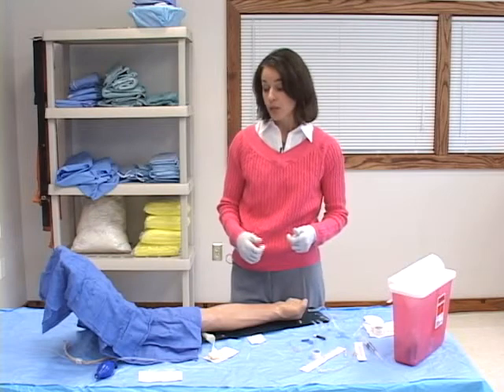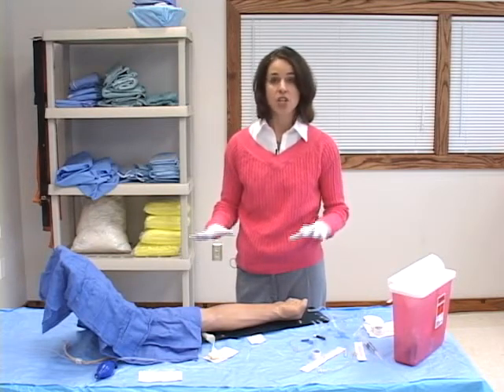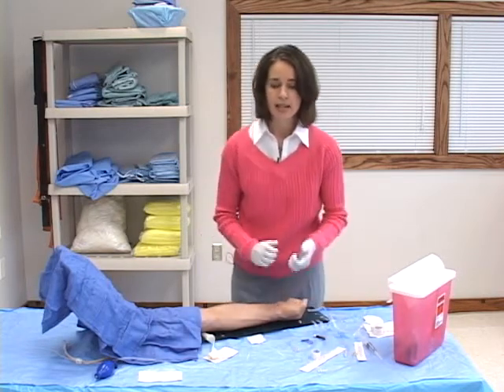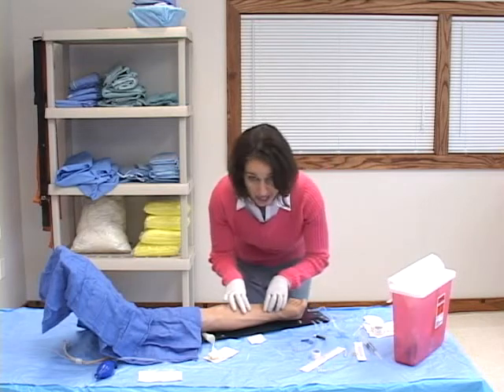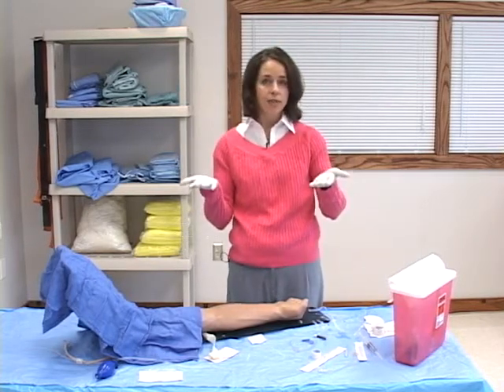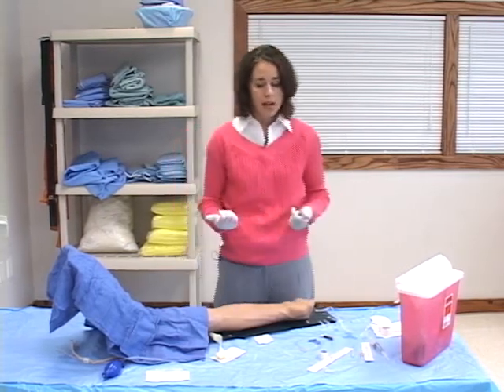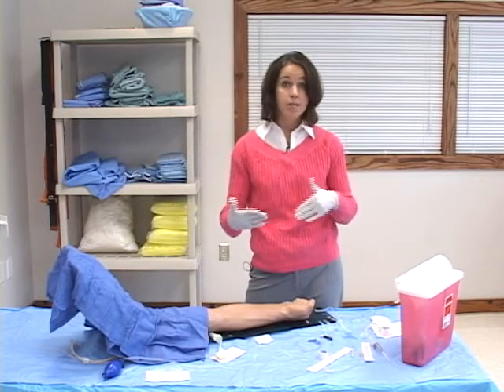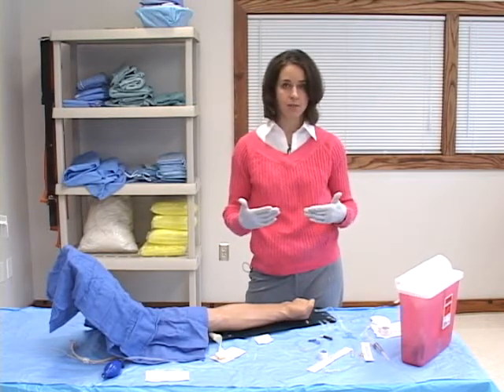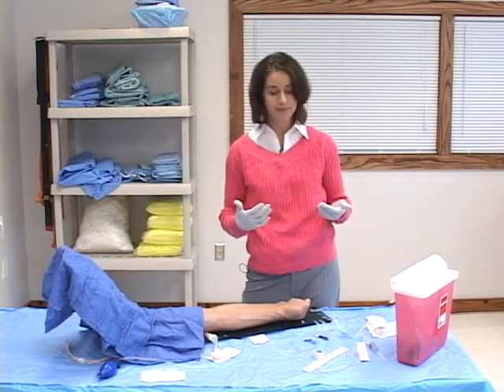And what you want to keep in mind is, I already discussed having the parents there, you want to have the child in a position where you're not leaning over a table trying to get to them, and you're not having to hunch down in order to get to the child. So oftentimes you can raise the level of a hospital bed, you can use a stool to sit on, you can change the side of the table that you're going to be on depending upon where the access is going to be, and then you can make your decision from there. Because you, as the one doing the procedure, need to be comfortable with your positioning.